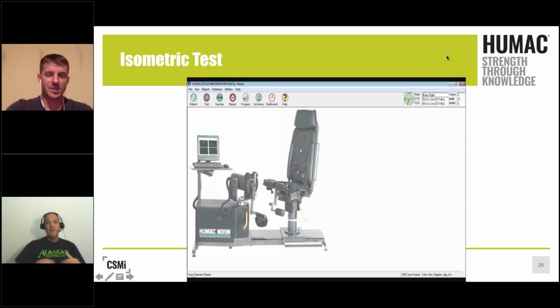That's similar to one of the better ways for us to look at the rotator cuff as well. Exactly. One of the better ways for us to really pay attention to this is the quadriceps concentric measurement relative to the hamstring's eccentric component, to see whether or not their quad-ham relationship is more appropriate. And they've been calling that the functional ratio.